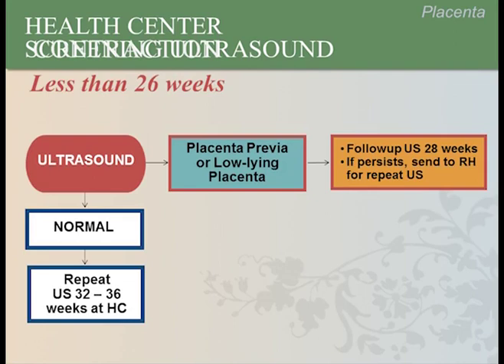Ask her to return for a follow-up ultrasound at 28 weeks. If the abnormality persists, send her to your referral hospital for a repeat ultrasound. Algorithms may vary somewhat according to local practice. You should consult your referral hospital for the algorithms appropriate for your practice. Note that in our algorithm, RH stands for referral hospital.